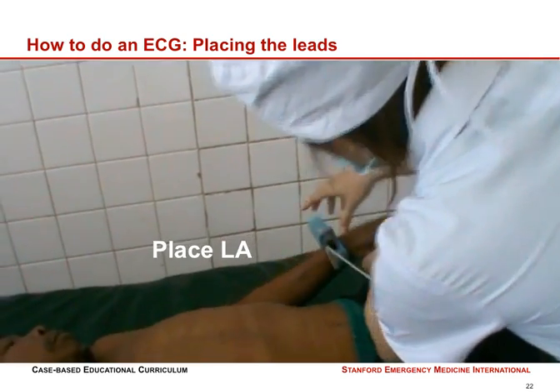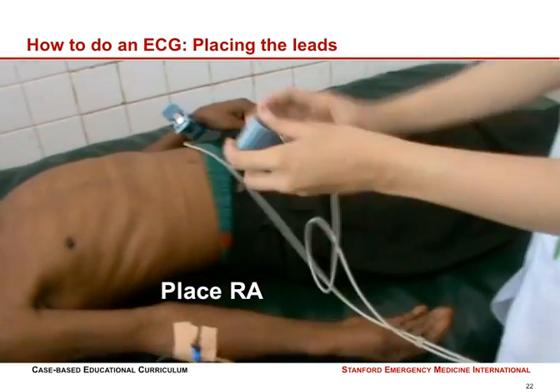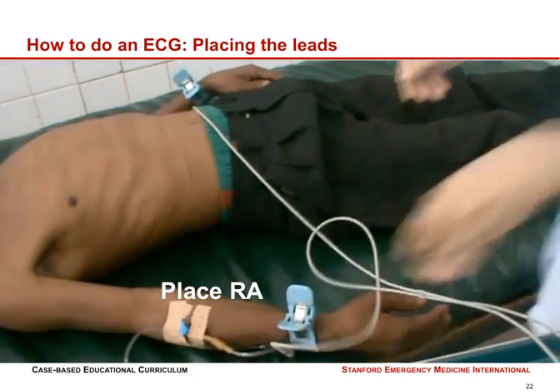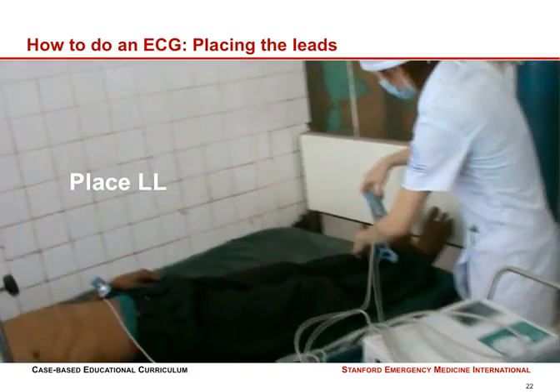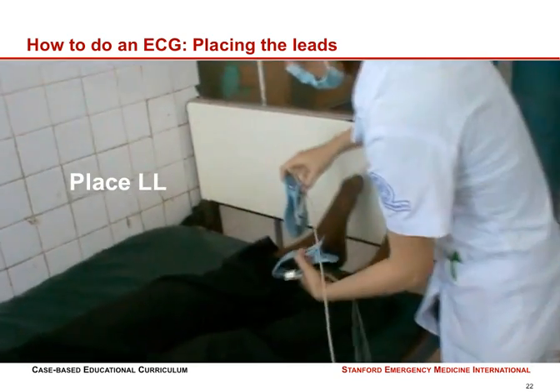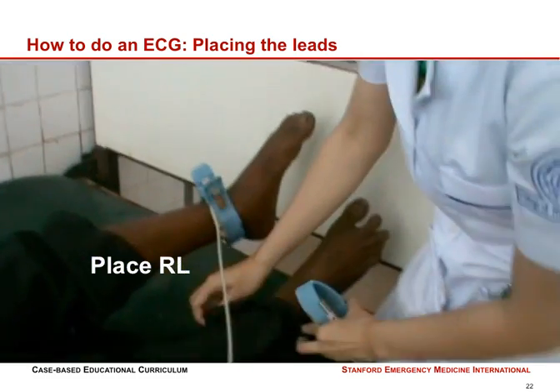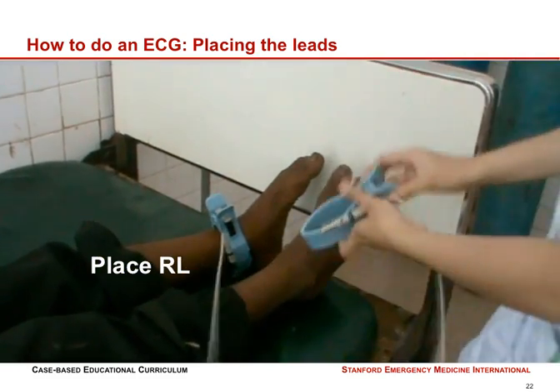Place the left arm limb lead. Place the right arm limb lead. Place the left leg limb lead. Place the right leg limb lead.